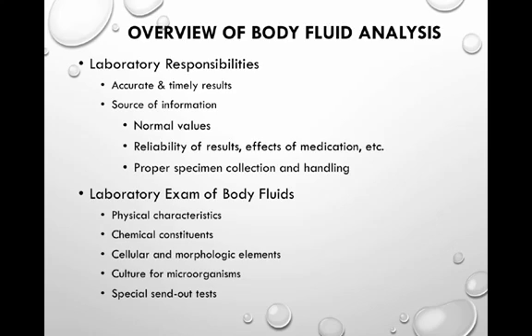Normal values, reliability of the results, and proper specimen collection and handling are really key when we talk about body fluid analysis. Depending on the physician's reason for collecting the body fluid, the examination typically involves evaluation of the fluid's physical characteristics, color, clarity, chemical analysis, microscope review of cells or any other morphological elements, as well as culturing for microorganisms. Special studies may be done in-house or sent to a reference lab.